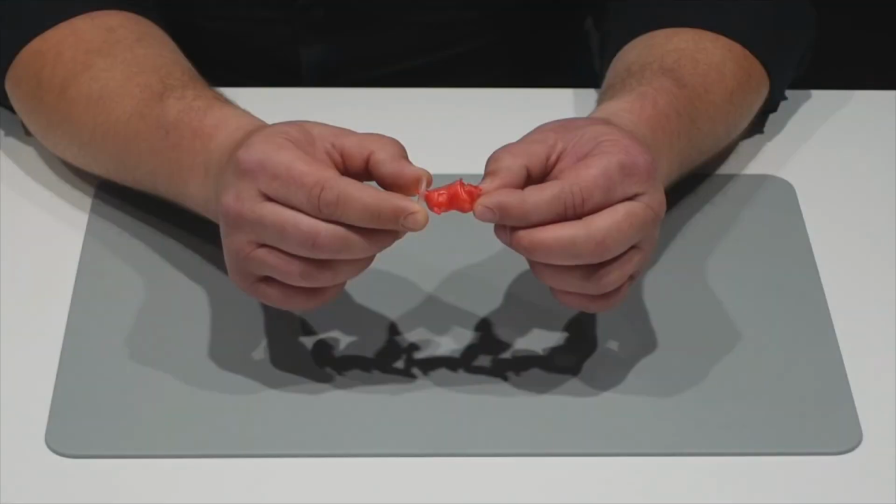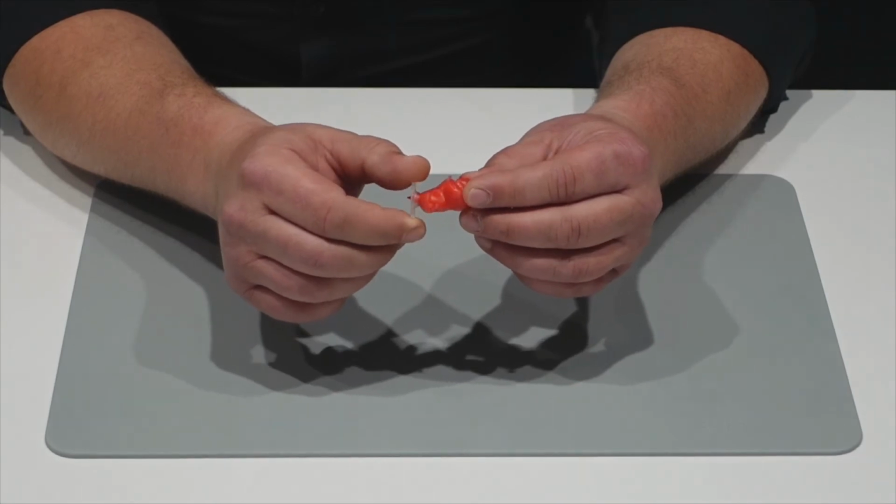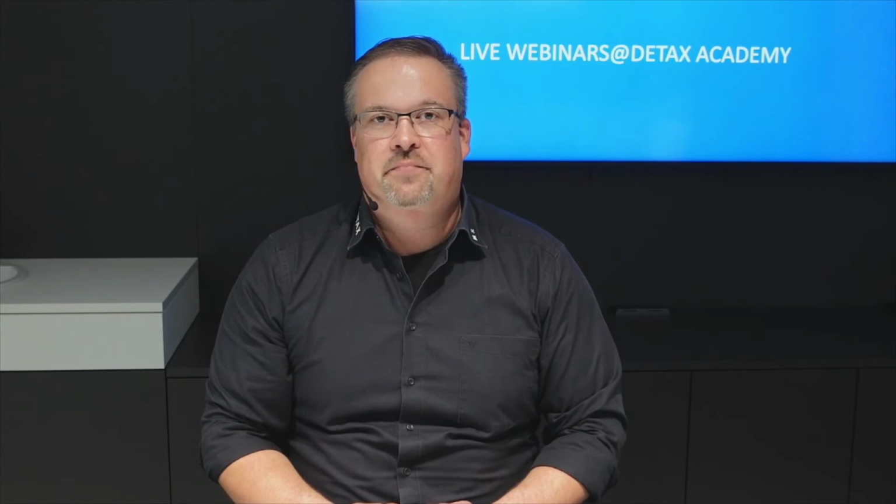One more trick is if you heat the forms with silicone, the ready forms, the full-filled forms like this one, if you heat it up a little bit, it is more flexible than the material and then it's easier to open it. From my point of view, with regular temperature, it is fine, but it is much easier when it's more flexible. But please do it only after final curing of the silicone, after the pressure box.